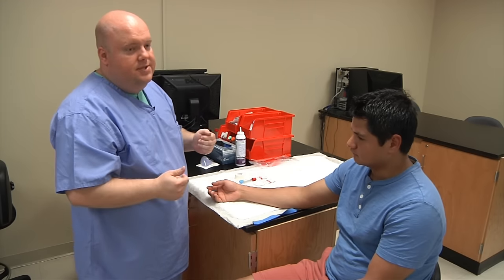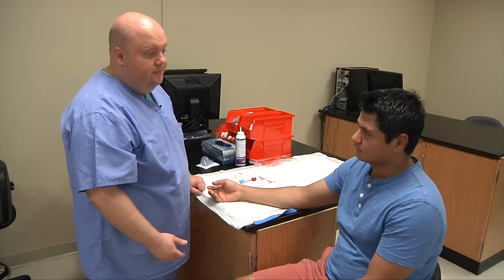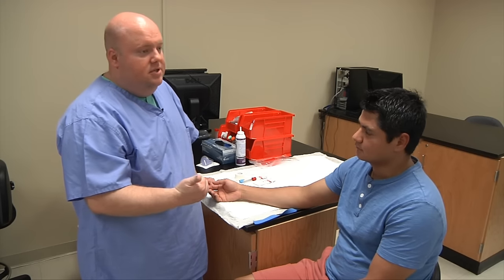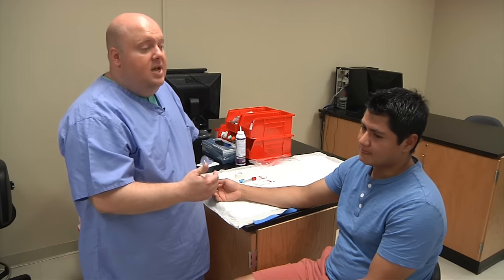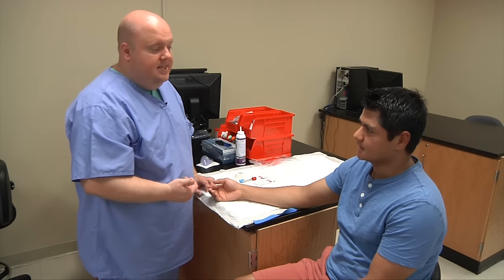After that, you'll introduce yourself to the patient: 'Hi, I'm Trevor from the lab. The doctors ordered some tests today. Do you mind if I collect these samples?' The patient shook their head indicating they don't mind. I've informed my patient, so I've achieved informed consent. Since the patient didn't verbalize anything back to me and they have their arms sticking out, I also have implied consent.